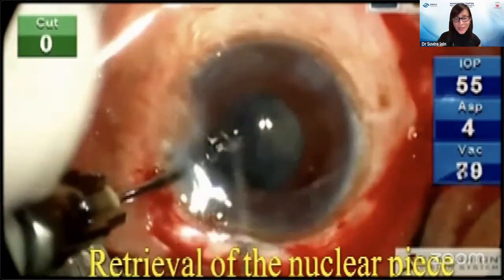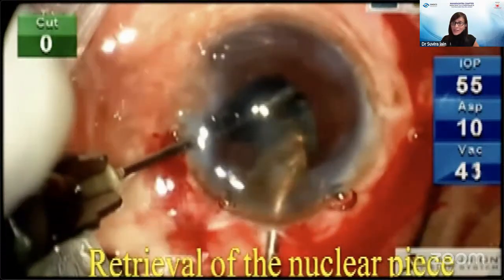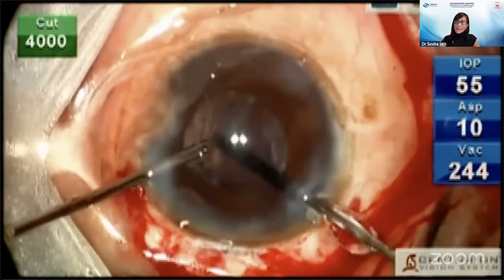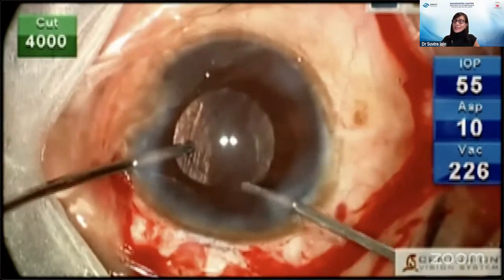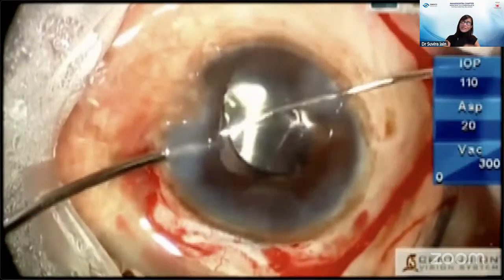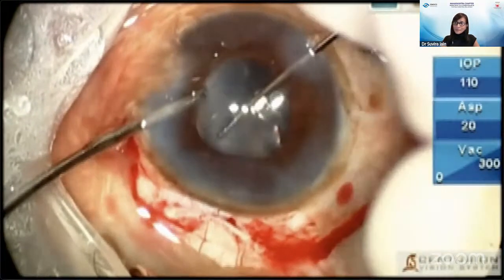Here you can see we are continuing with the limited anterior vitrectomy, and upon the completion of the vitrectomy, now that you already have an enlarged tunnel, with significant ease, a three-piece IOL is slid in the correct position in the ciliary sulcus. I prefer these lenses even to PMMA lenses. They give you adequate stability.